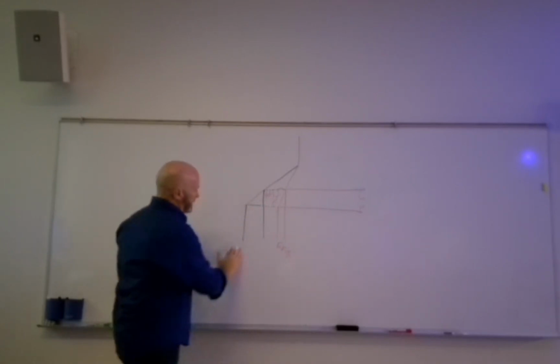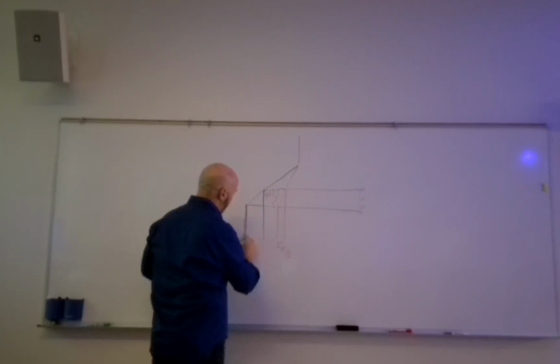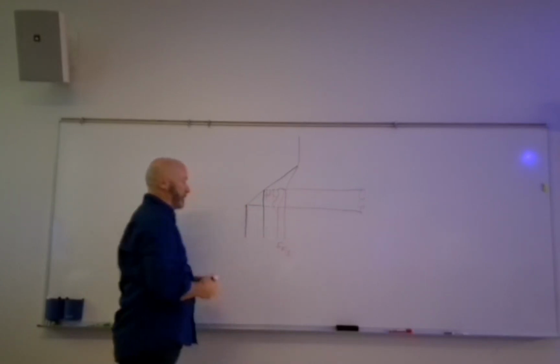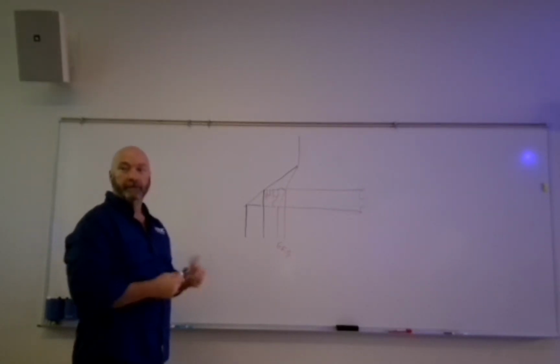So now let's look at what happens with our effective focal spot. What is it? And I kind of cheated a little bit there. I drew it at a little bit of an angle. I'll make it more vertical. In a word, what is that? Same word. Bigger. Right.